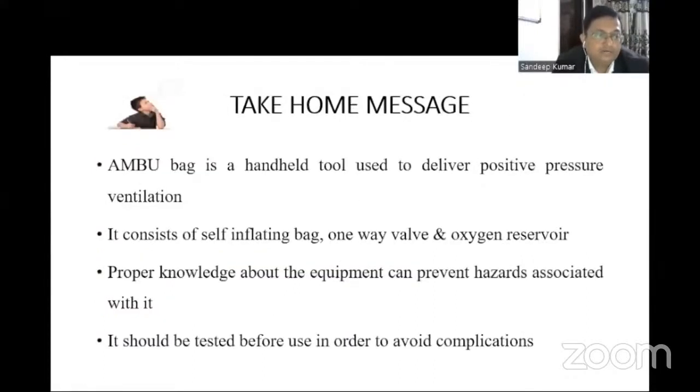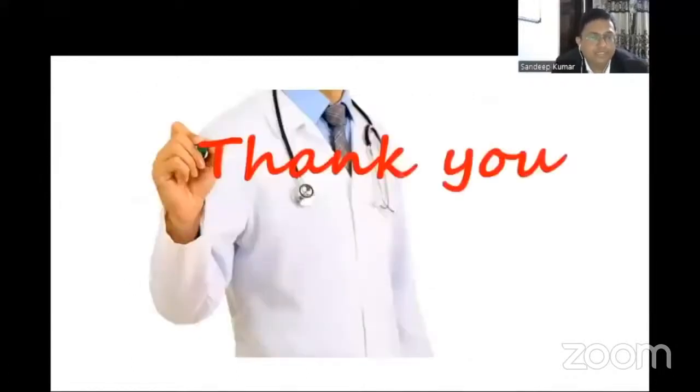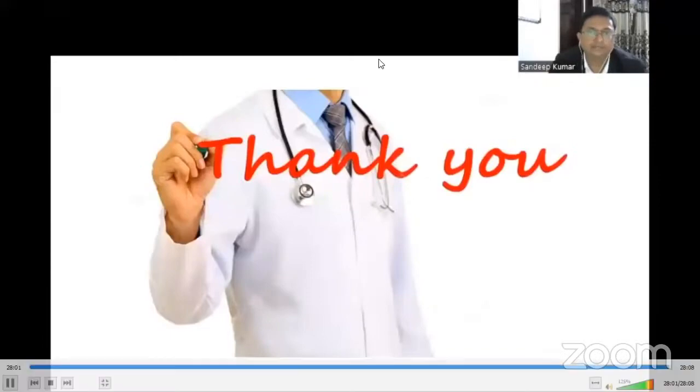Take home message for this lecture: the AMBU bag is a handheld tool used to deliver positive pressure ventilation. It consists mainly of a self-inflating bag, one-way valve and oxygen reservoir. Proper knowledge about the equipment can prevent hazards associated with it, and it should be tested before use in order to avoid complications. So the testing is very important before you use it. Thank you very much, and all the best for your exams.